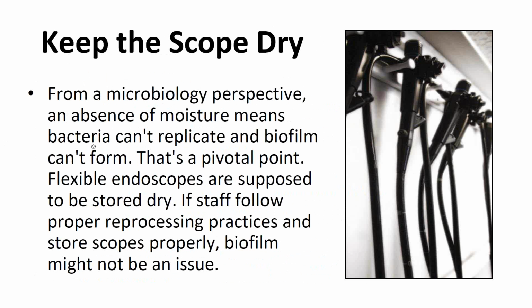Next slide, please. We need to keep these endoscopes dry. So from a microbiology perspective, an absence of moisture in the endoscope or in the channel means that bacteria can't replicate, and thereby we prevent biofilm from forming in the first place. So I want to make sure that everybody understands that.